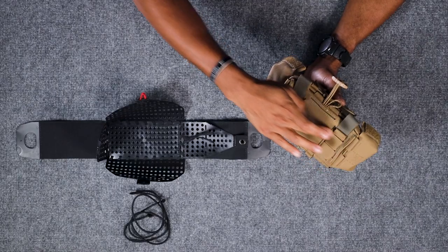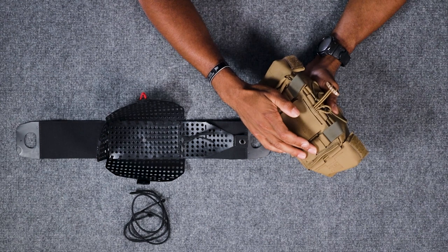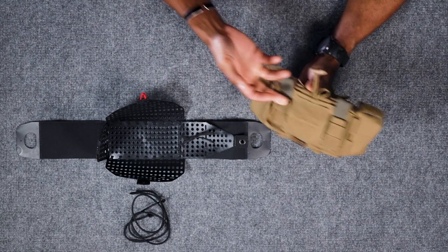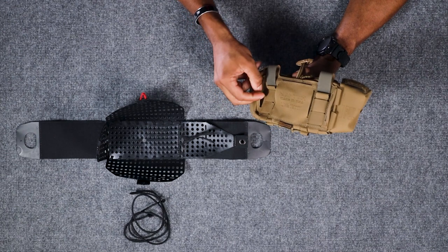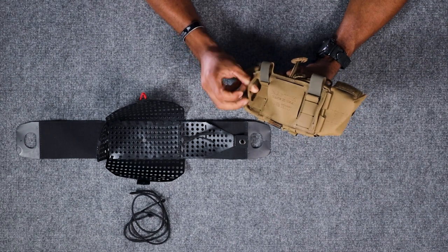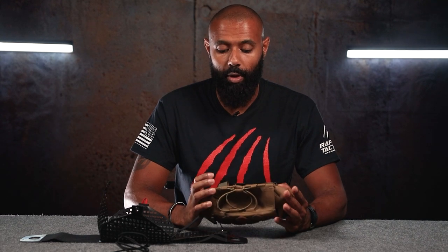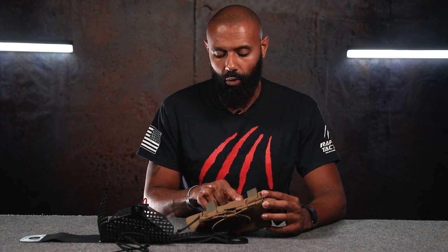You can see along the back here, it can attach with MOLLE. It could also attach with a belt. You see you have this little slot here, and then you have one that's even wider over here, in case you just want to put it through those loops. This is designed to work with a belt or with MOLLE.